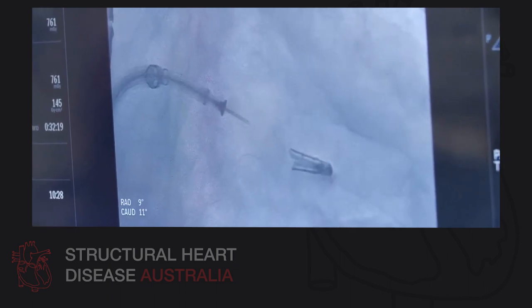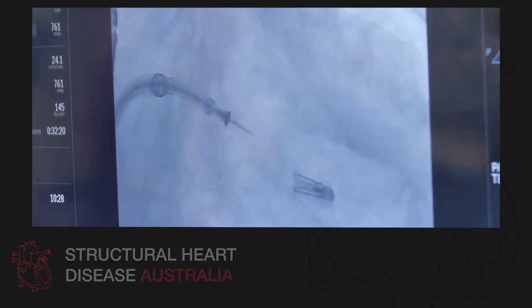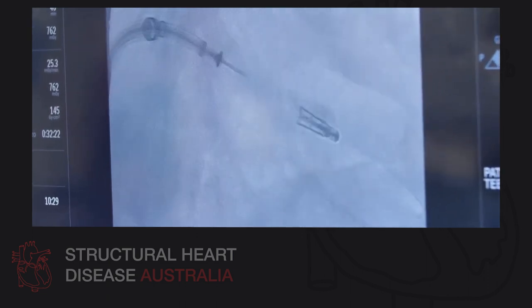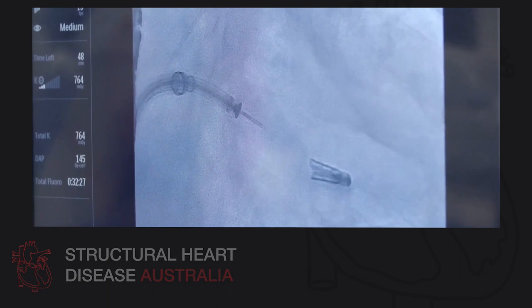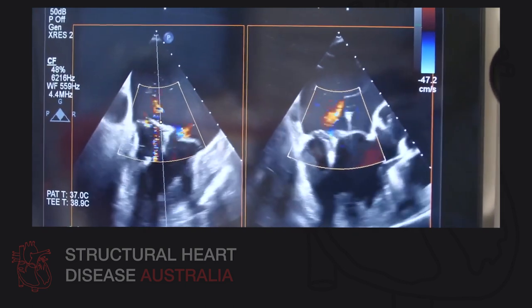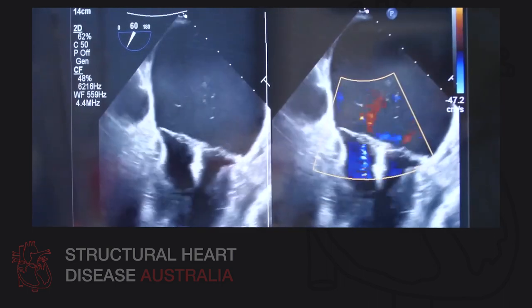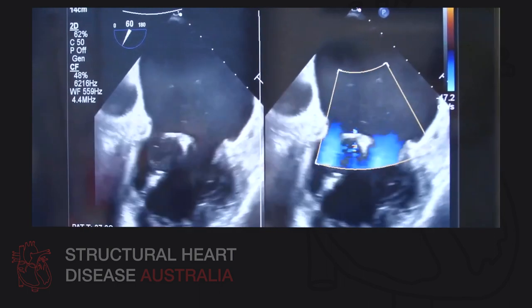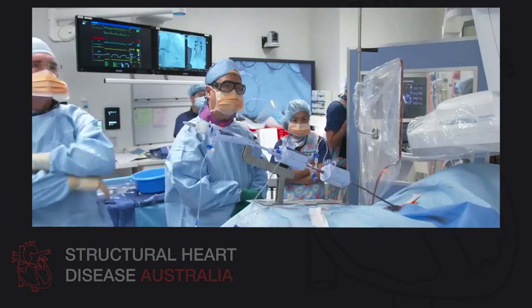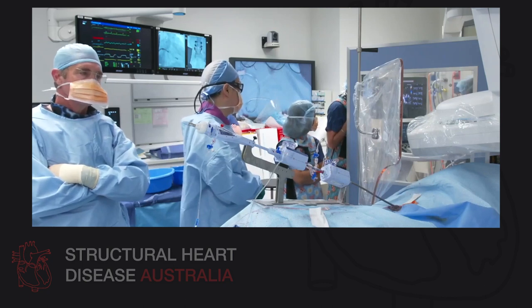And this is associated with increased movement, actually, in this case of the device because of the anterior leaflet prolapse. I think it's more rocking than we'd normally expect. Let's have a look at our device there. So despite the movement on the X-ray, the mitral clip XTR is securely on the anterior and posterior leaflets. And really, there's very little residual MR. We're happy with this final result. I don't think there's indication to put another mitral clip in.